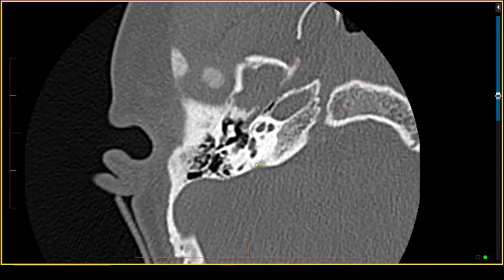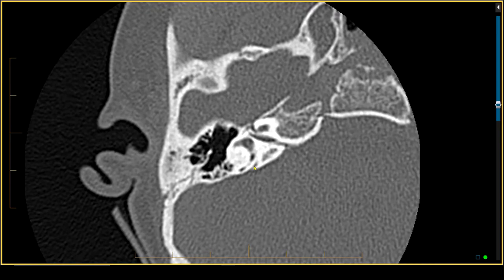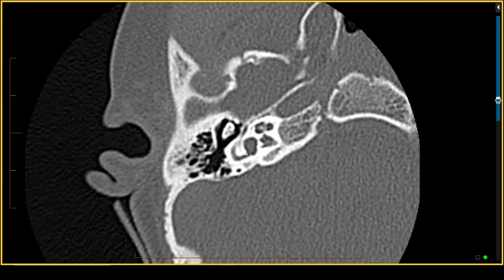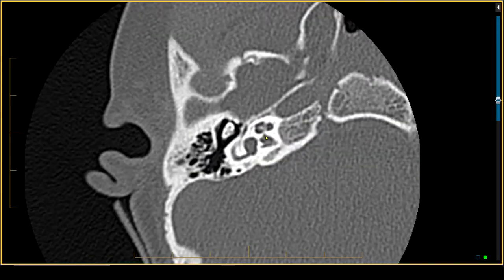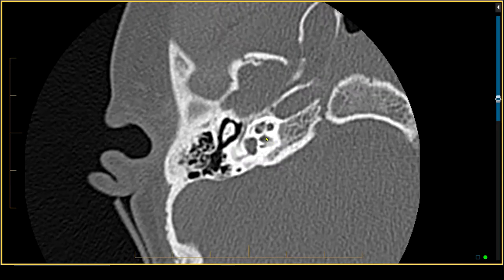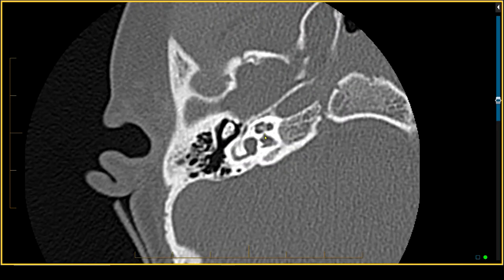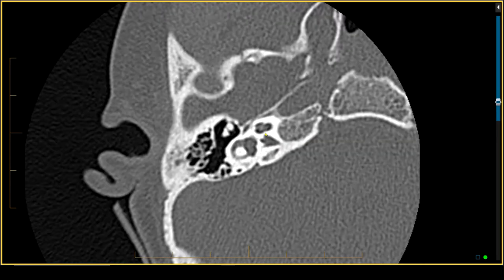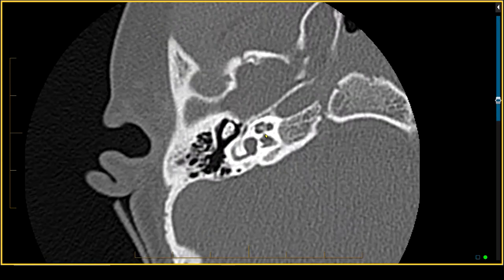Moving to the inner ear, we first look at the vestibular aqueduct, which is normal in its caliber, then the vestibule and the cochlea. This is an example of very tight cochlear aperture stenosis. Coming from the internal auditory canal to the cochlea, we can barely see the opening — this is cochlear aperture stenosis. The measurement has been established by multiple groups: 1.5 millimeters or less represents cochlear aperture stenosis.